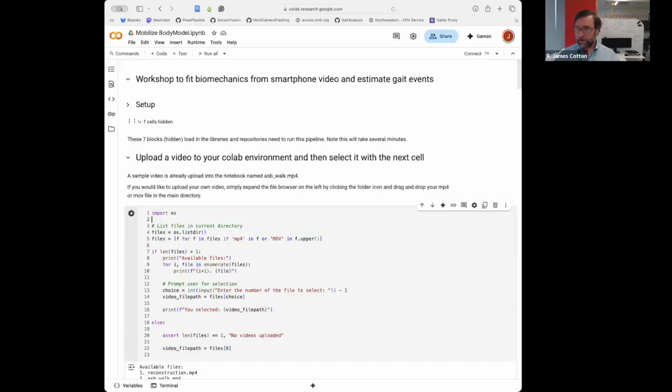All right. Let me try again. Okay. Looks good. And hopefully people have the notebook up. I've done this workbook in person before, but I haven't done this before over Zoom, so I don't know how I'm gonna do it without feedback, but I'm just gonna walk you through it.